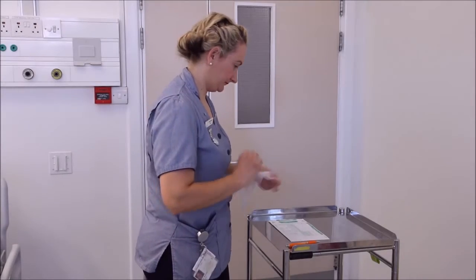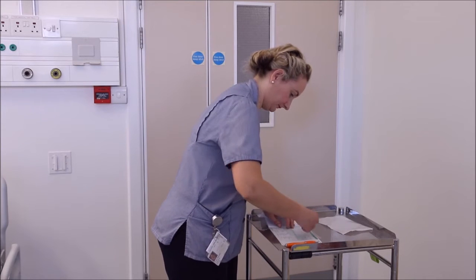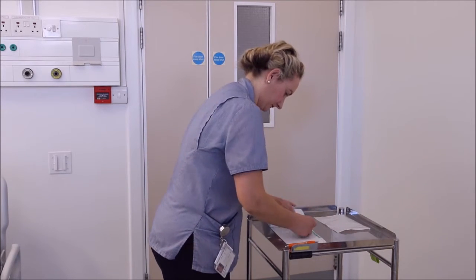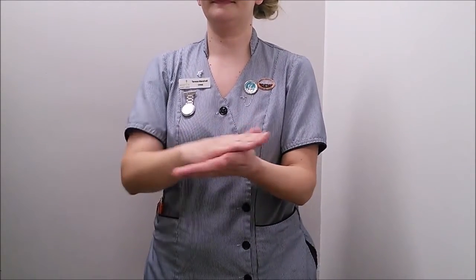Collect and fill out the microbiology form. It is important to ensure you complete the forms fully and that the patient history is relevant. This must include recent or current antibiotic use, as this information aids the interpretation of the blood culture by the microbiologist. Decontaminate hands.